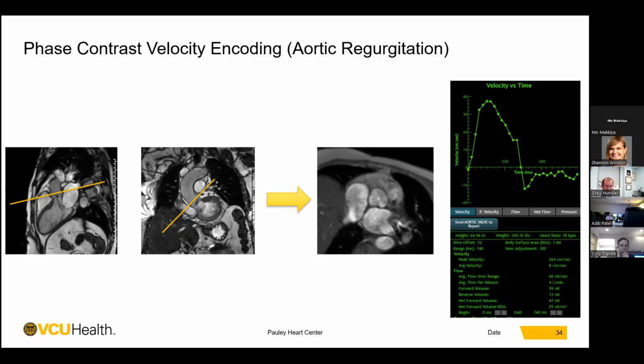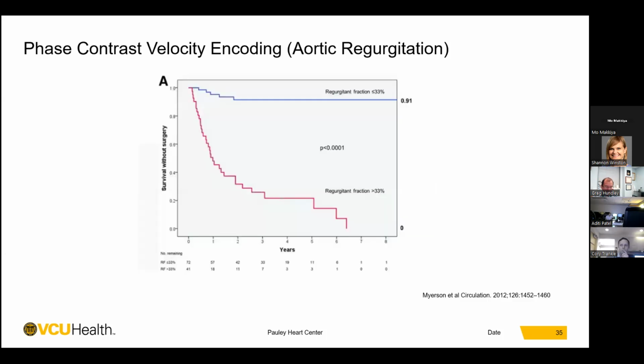Another indirect method we can utilize if our hands are tied is comparing the LV and RV stroke volumes obtained by SSFP cine planimetry. However, this is not reliable if there are significant coexistent mitral or tricuspid regurgitant lesions.